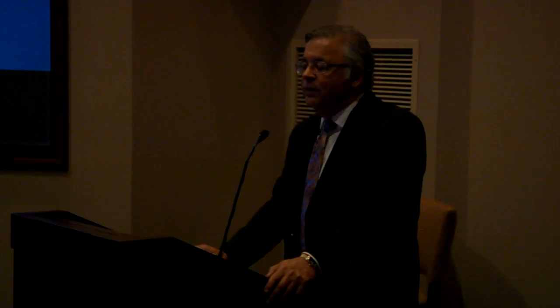And finally, it goes without saying that you just have to be careful. If you've got a busy day, put the studies aside, show it to your partner. If you're going to look at this in the clinic, use a split screen display to look at them so you can correlate the diffusion from the non-diffusion images to make sure that what you think is abnormal is matching up with the corresponding anatomy so that you minimize error.